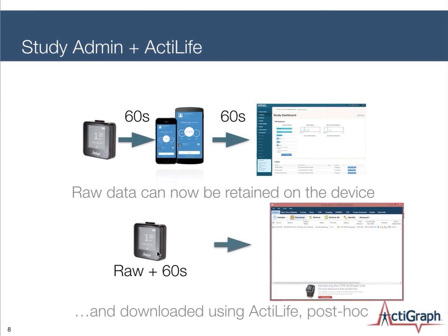And we have elected to choose this group, you, who are currently customers of ours, to tell you about this feature in the event that you'd like to try it out on your current study. We've got some promotions that we want to run with you, give you the option to see if this system works for you. And so that's why we're telling you about it today.